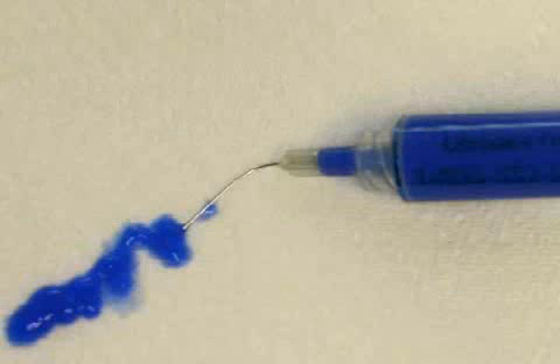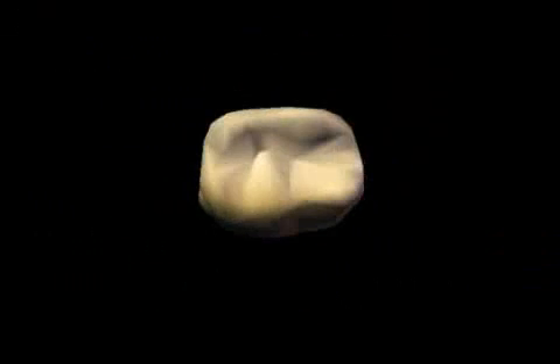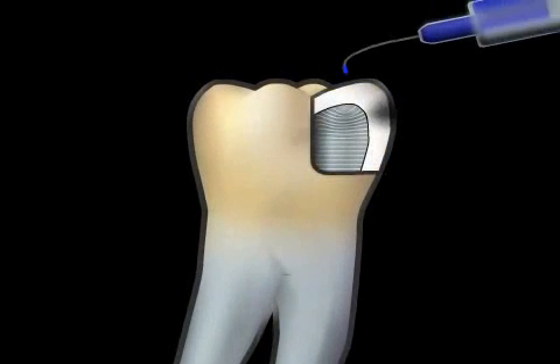Etching gel is used in dentistry to enlarge the surfaces of areas to be glued. These can be either the tooth itself or, usually, ceramics and plastics. Unlike cementing, in the process of gluing, also called bonding, the surfaces to be glued are specially treated. Etching makes the surfaces of the tooth or ceramic inlay rougher, called a micro-retentive pattern.